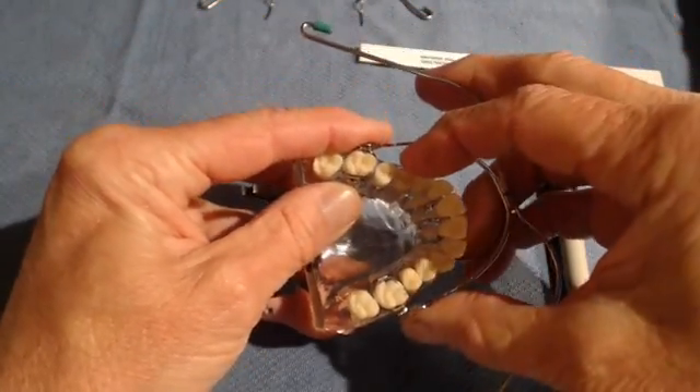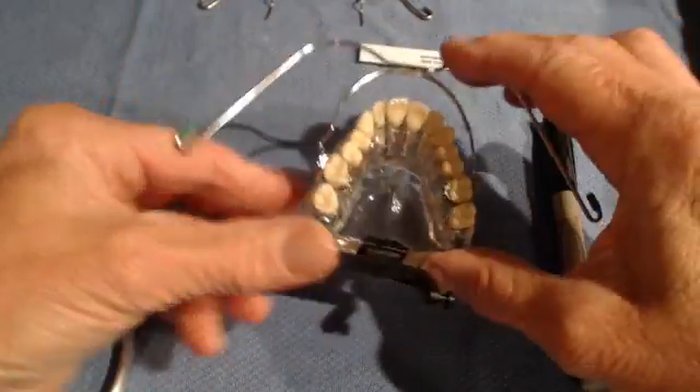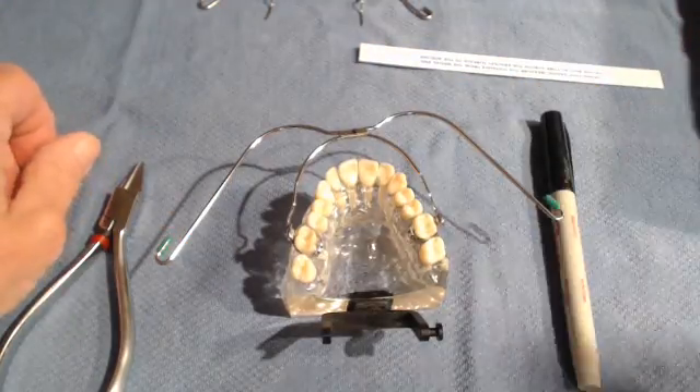I hope this has been educational and informative. Remember, headgear delivery should only be about a five-minute experience — no more than that. So do not fret about headgear delivery.